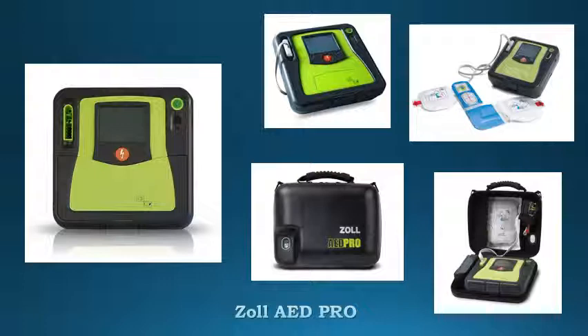Available as semi-automatic only or semi-automatic with manual override for ALS professionals. Built-in internal memory and external USB memory technology allows expanded data storage capacity and maximum flexibility for data management and transfer.